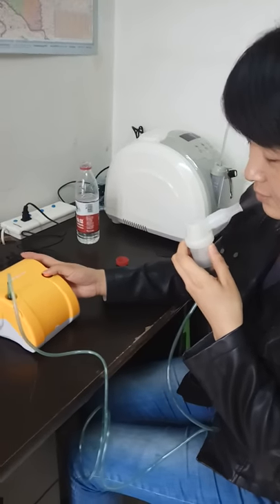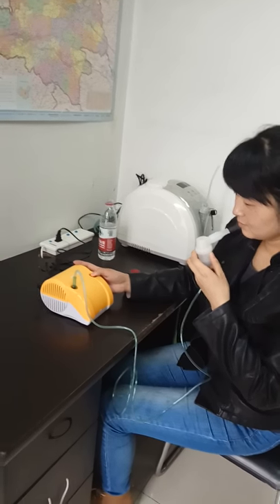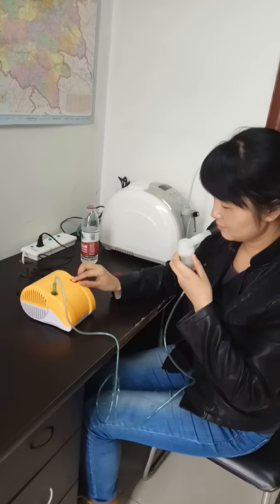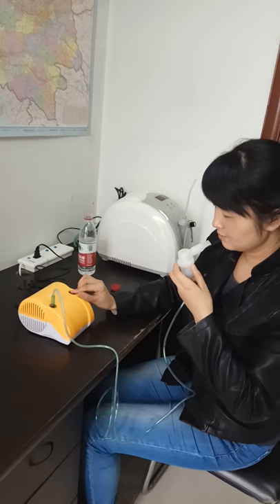Ok, so this is the whole video showing how to use our medical nebulizer. Thank you.